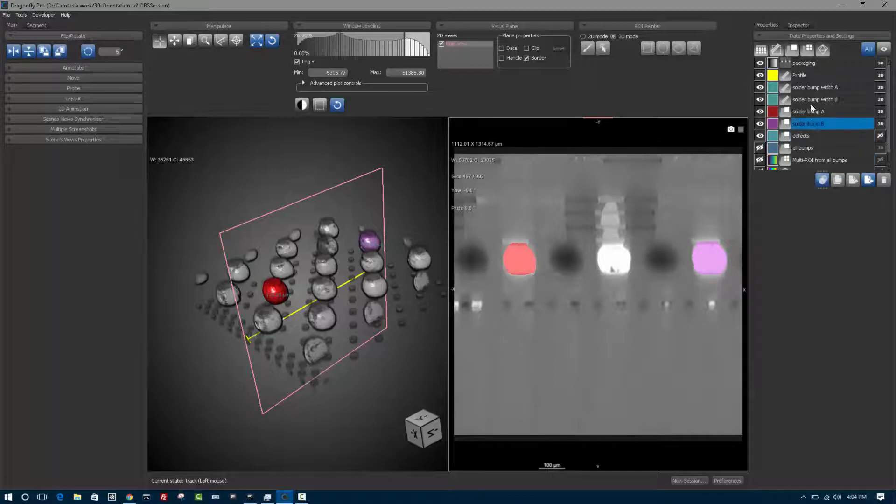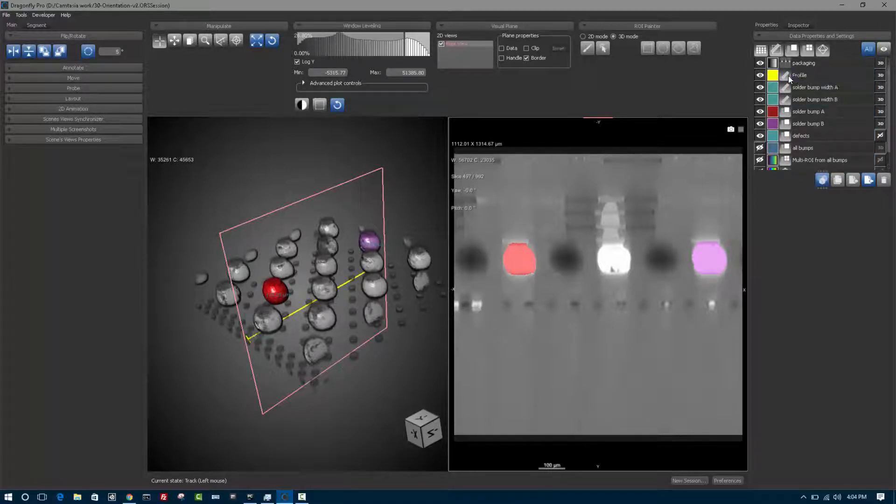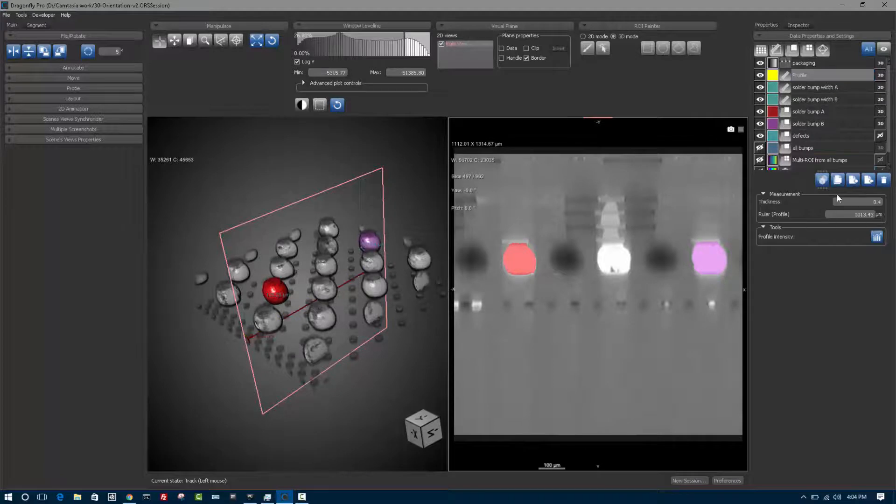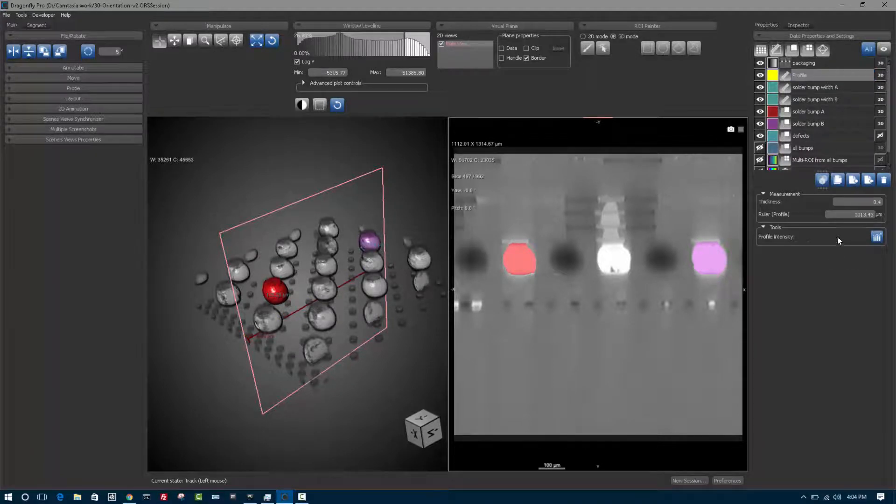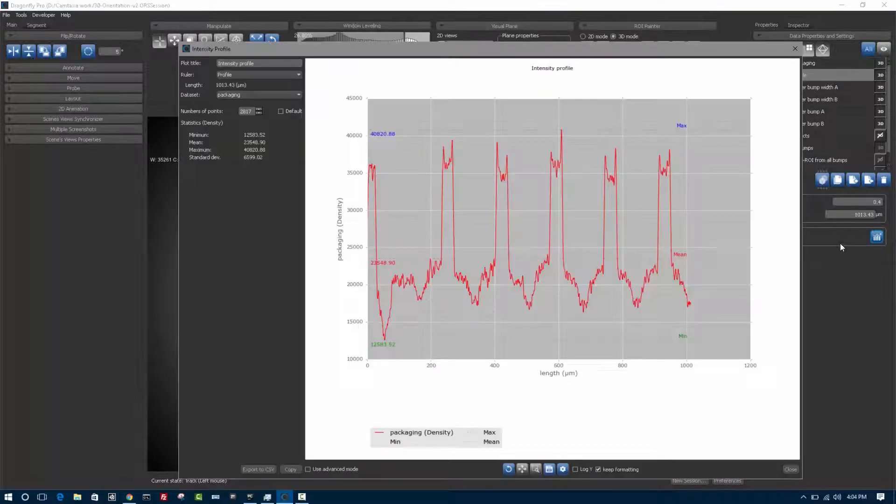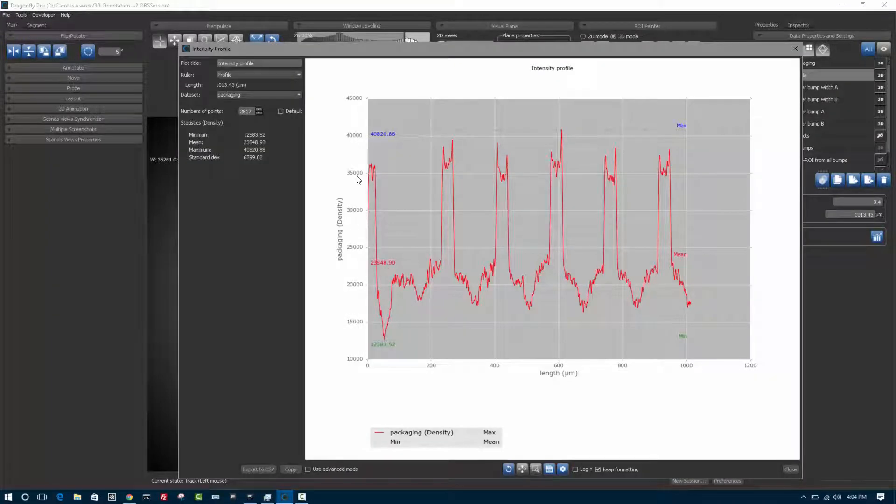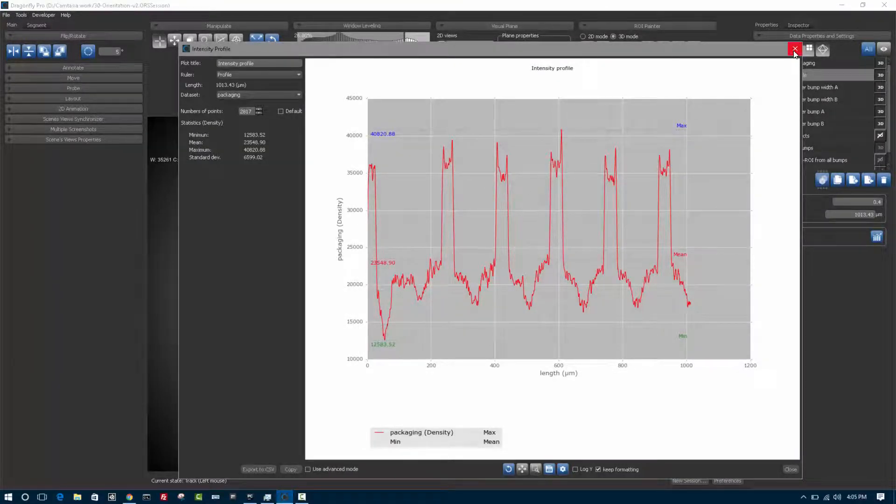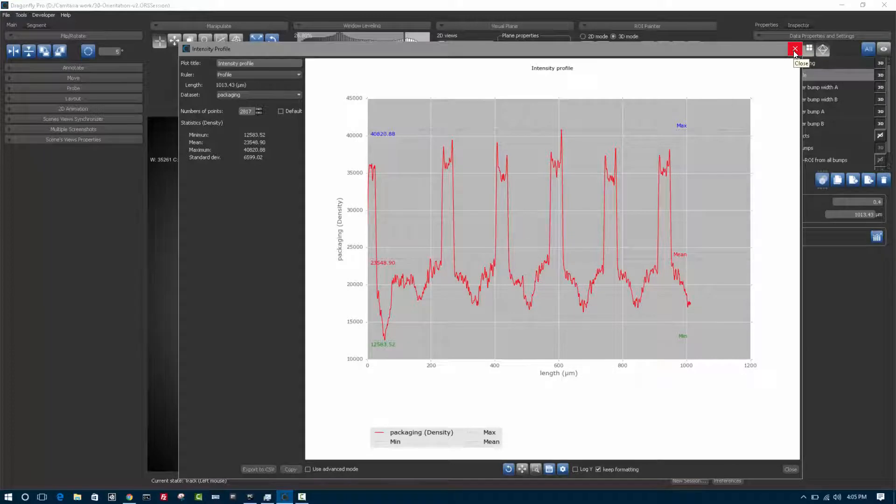Anytime you click on a particular scene element, for example, if I click on this ruler called profile, I'll see its attributes below. You're able to interact with attributes such as clicking on this for profile intensity to see how this ruler intersects line intensities on this particular image data set.